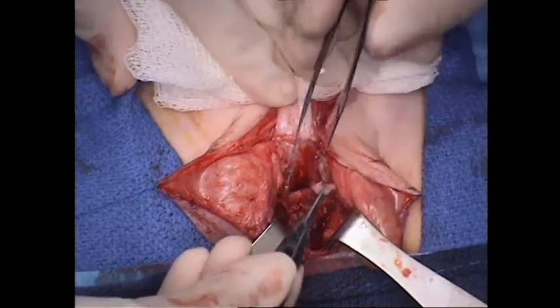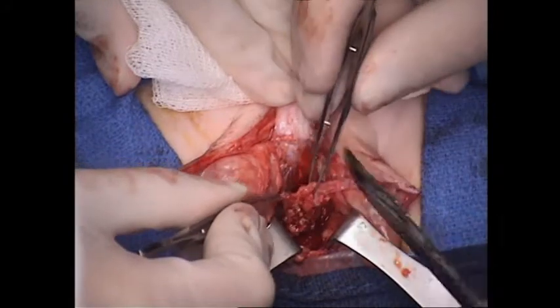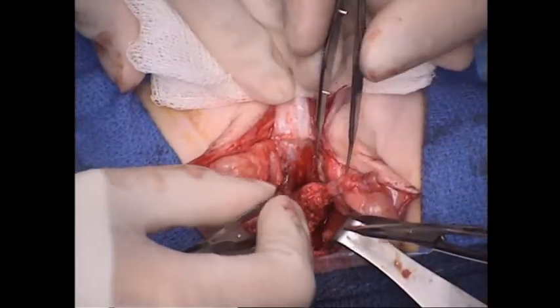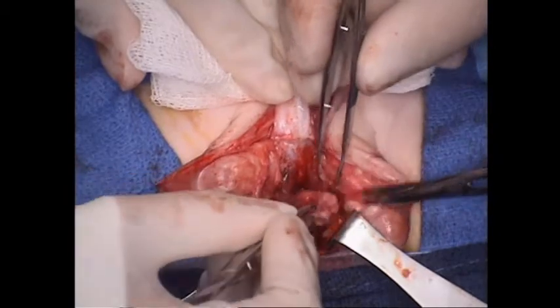Sure, there's no twisting on your urethra. We're going to remove just a little bit of this muscle from the side to again gain the maximum amount of stretch as we can on our urethra. Okay.